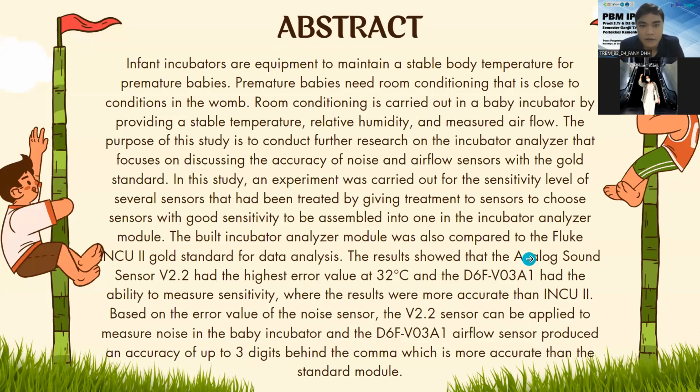Infant incubators are equipment to maintain a stable body temperature for premature babies. Premature babies need room conditioning that is close to the condition in the womb. Room conditioning is carried out in a baby incubator by providing a stable temperature, relative humidity, and measured airflow. The purpose of this study is to conduct further research on the incubator analyzer that focuses on discussing the accuracy of noise and airflow sensors with the gold standard.